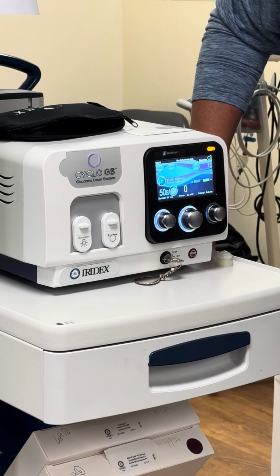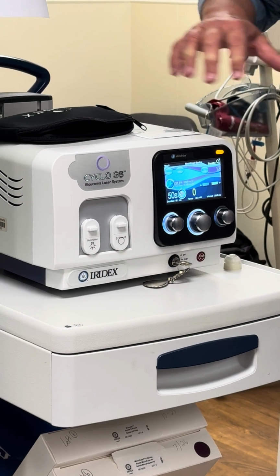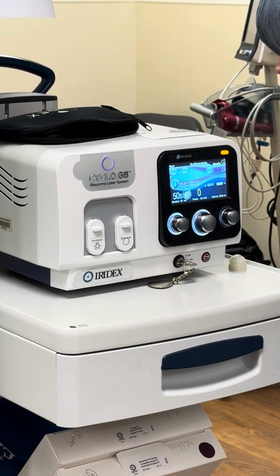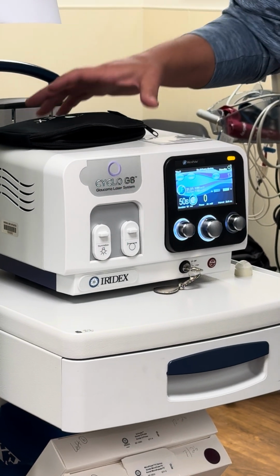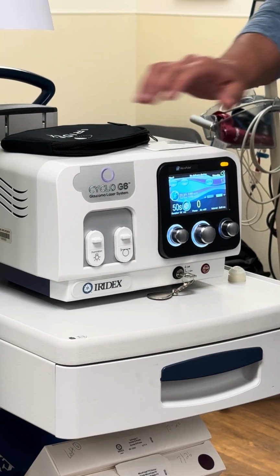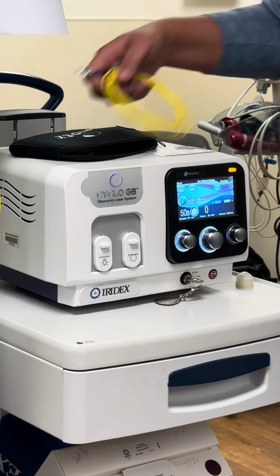So when it comes up to this screen, the most common thing to do, there's presets in here for what the doctors want, the most common settings. So for micropulse, do we have the probes? Oh, thank you. Well, we've got the two in your hand.